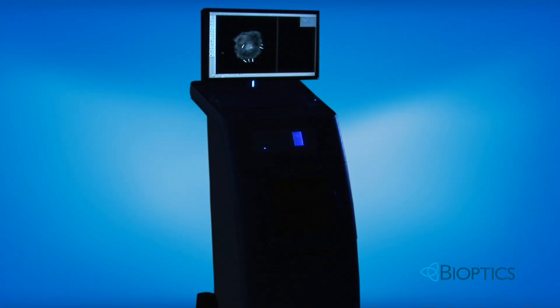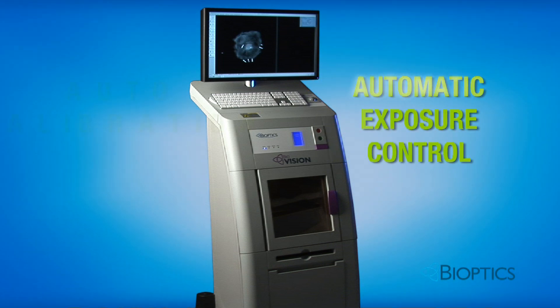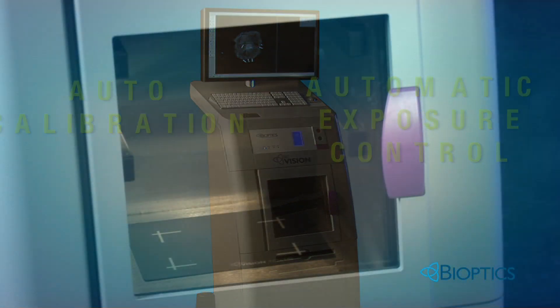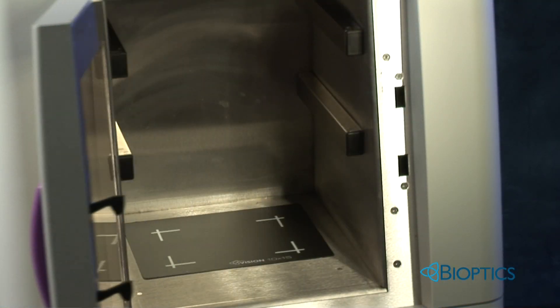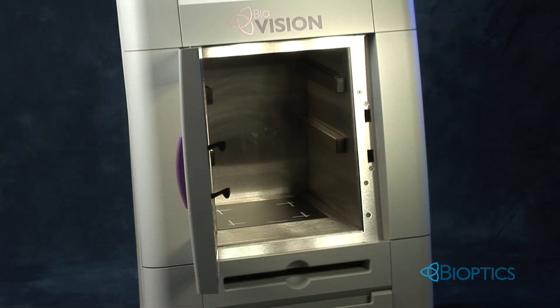Several important features set the BioVision system apart. The automatic exposure control and auto calibration features allow quick and easy operation at the touch of a single button. The exceptionally high chamber yields a longer source-to-image distance, ensuring outstanding sharpness edge to edge.